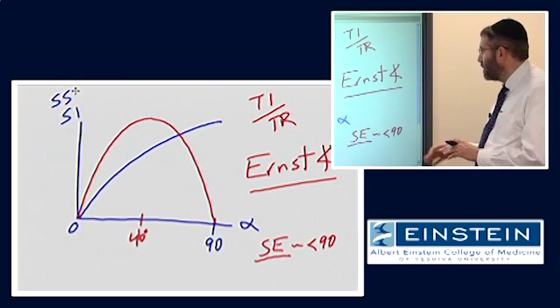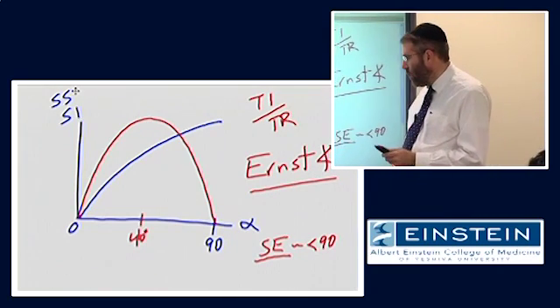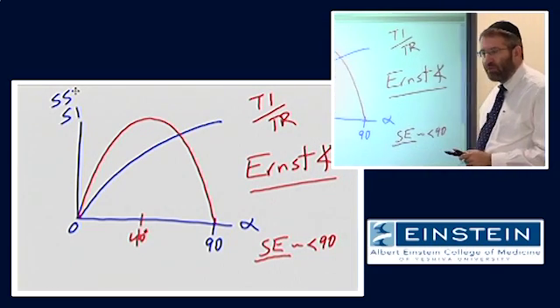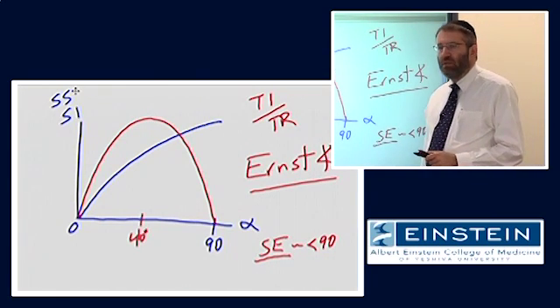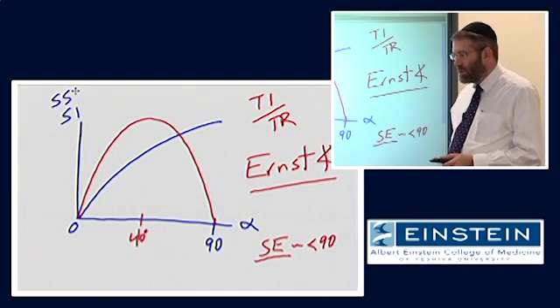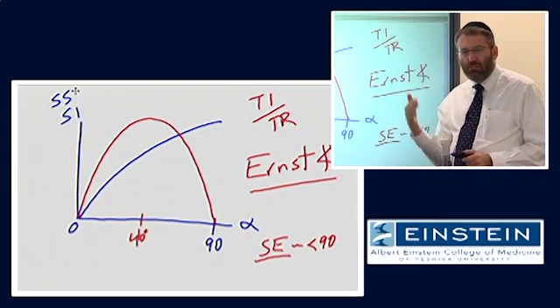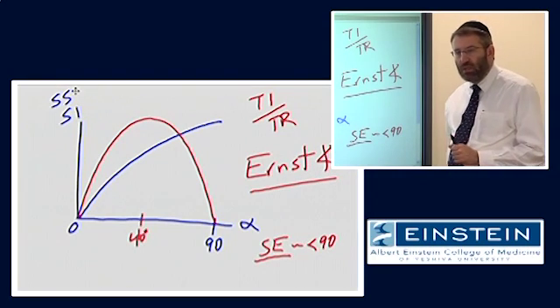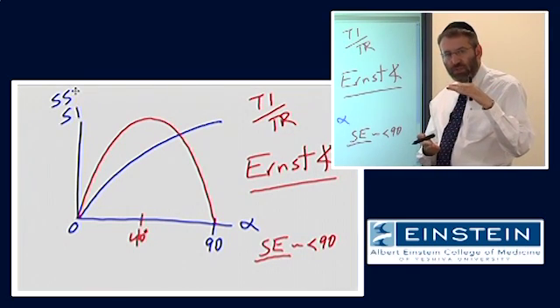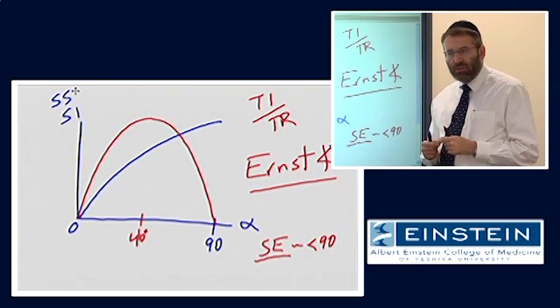Okay. So one way that we can choose the flip angle would be to maximize signal. So I want to point out one other option for why we might choose one flip angle over another. Let's make an assumption that we're imaging with a relatively short TR. Okay. So if we're imaging with a relatively short TR, we forget about this whole flip angle thing for a minute and just go back to Monday when we talked about T1 contrast and how shortening the TR is going to bring out differences in our signal that reflect the fact that spins recovered their longitudinal magnetization at different rates, had a different T1. Does that sound familiar?